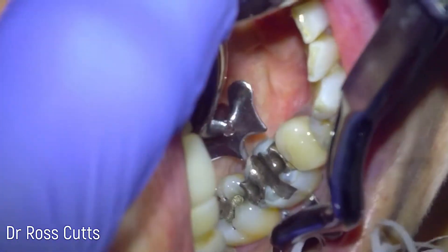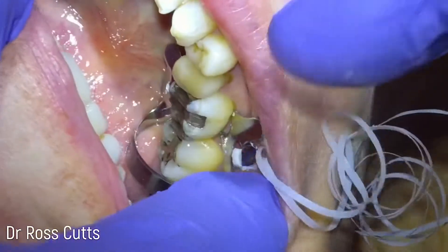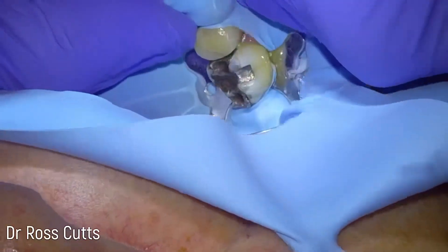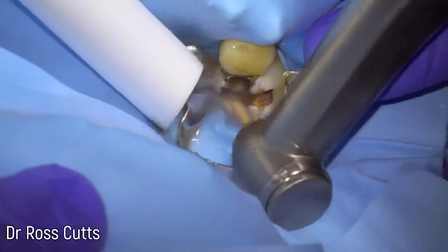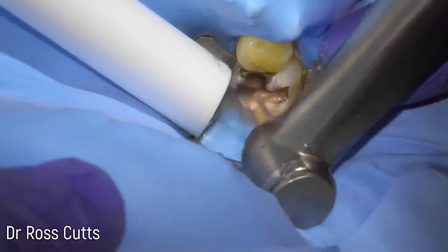We start by putting a rubber dam on — a little clamp that clamps over the tooth and then we stretch a rubber sheet on. There are several ways to do this but this is just the way I've been comfortable with for years. We always have to ensure that the clamp is flossed for health and safety, and then we start by removing the old silver filling.